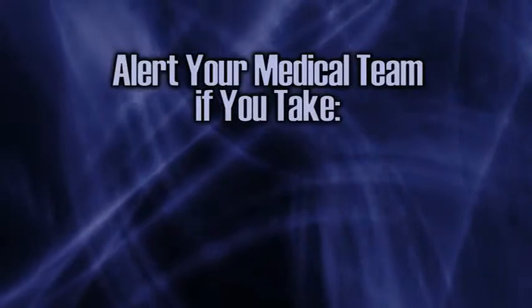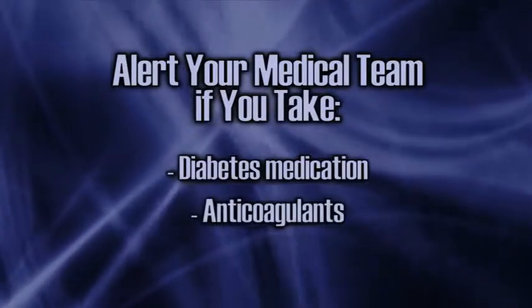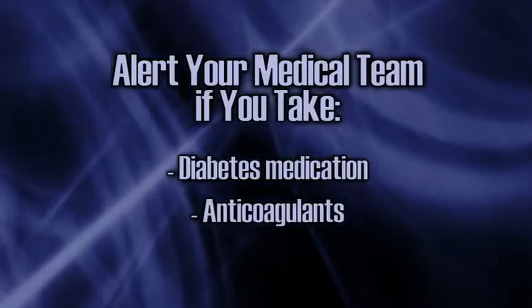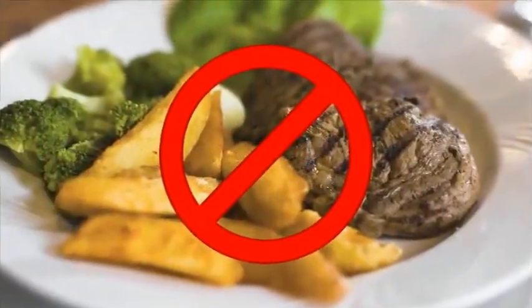It's especially important to let them know if you take medicine for a diabetic condition, or if you take anticoagulants, sometimes called blood thinners. You'll be given instructions in advance that will outline what you should and should not do in preparation for the upper GI endoscopy. Be sure to read and follow these instructions. It's very important that you not eat or drink at least 4 hours before your procedure. Be sure to discuss your doctor's recommendations. Any food in your stomach will block the view through the endoscope, and the food could cause you to vomit during the procedure.